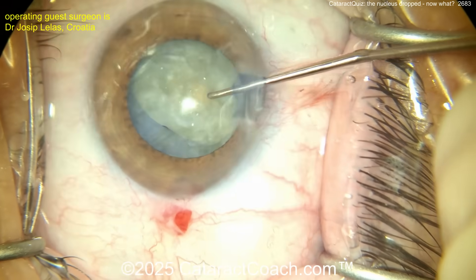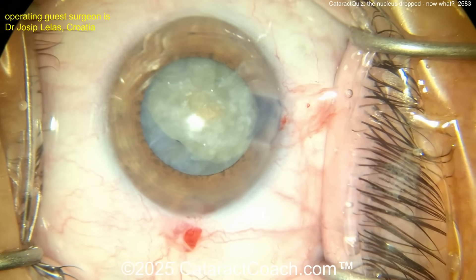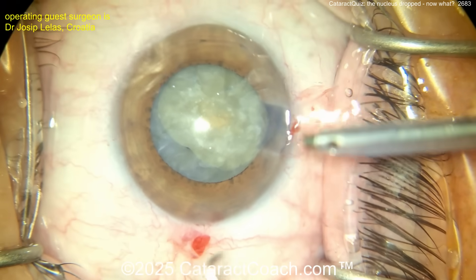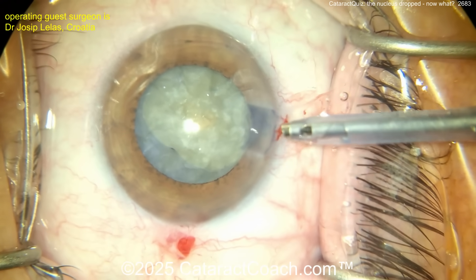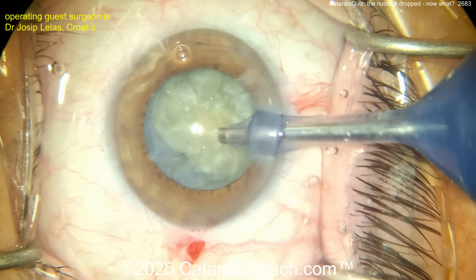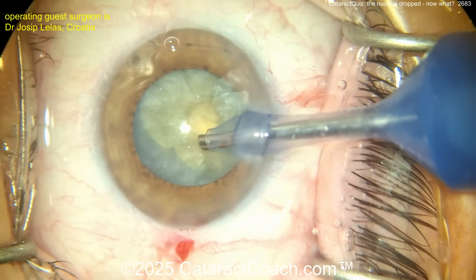That all looks pretty good, and I don't know if there's any posterior capsule weakness yet. You saw the title slide — you know what's going to happen. Let's watch the video together, watching it for the first time. Going in with the phaco probe — you just don't want to put stress on the bag, especially in that one area.